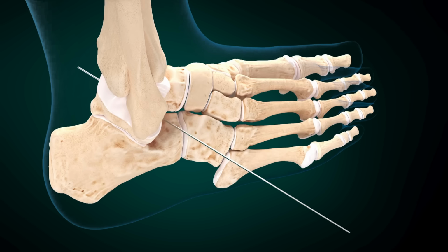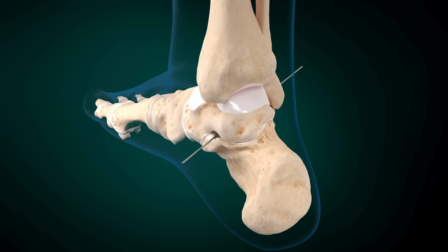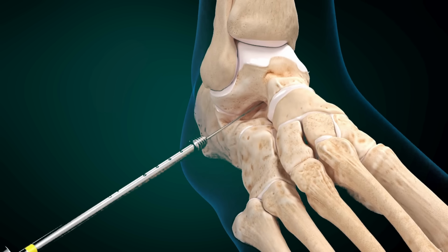If desired, a small medial skin incision can be made to allow the passage of the guide wire through the skin. Secure the wire with a clamp. The wire will exit below the posterior tibial tendon. The trial sizers are used to determine the appropriate size.